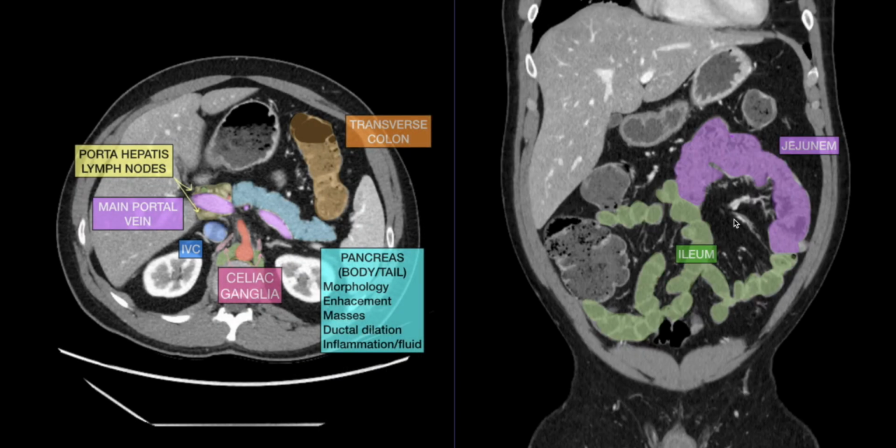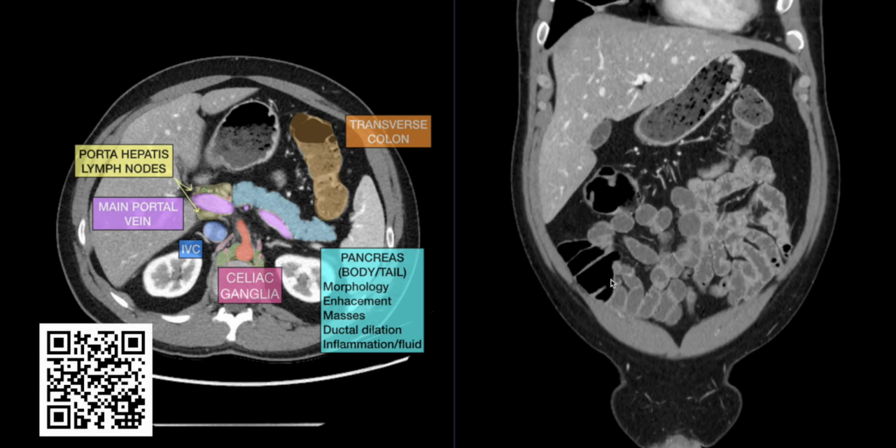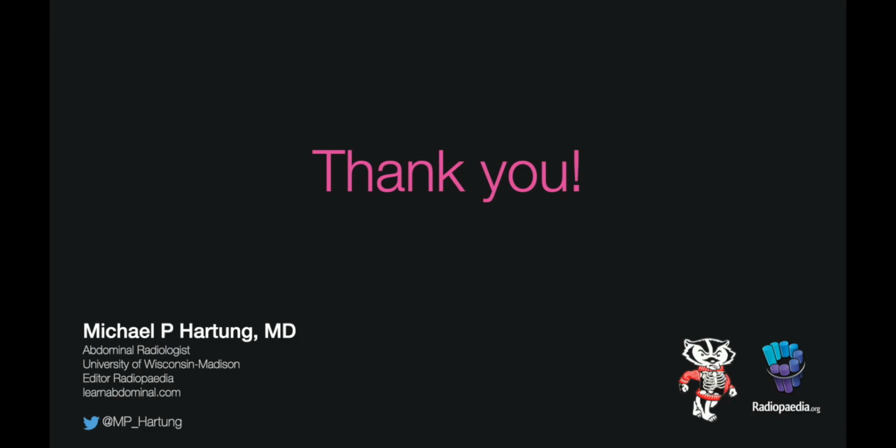I hope you found this review of key abdominal CT anatomy and search pattern helpful, and encourage you to spend some time reviewing the annotated and non-annotated images linked to this lecture to further expand your understanding of abdominal CT anatomy. Thank you for your attention, and I hope you've enjoyed this review of abdominal CT.